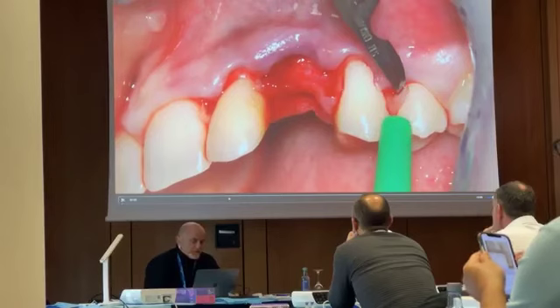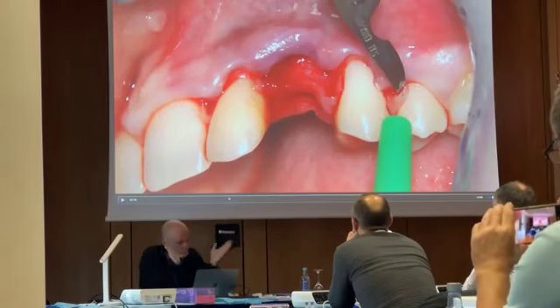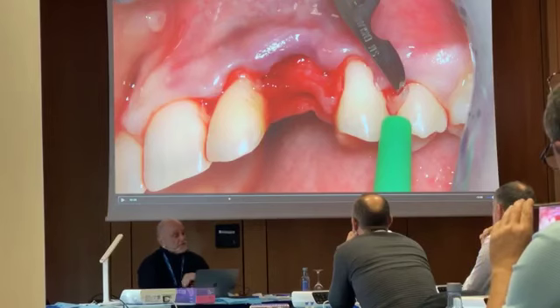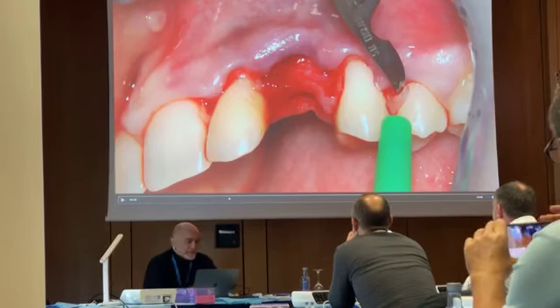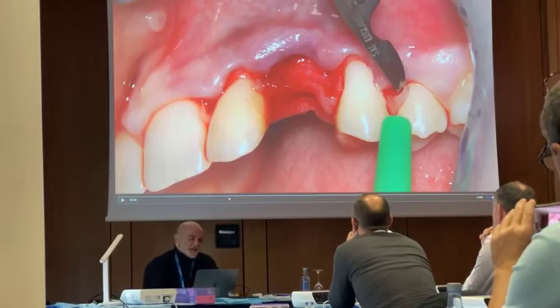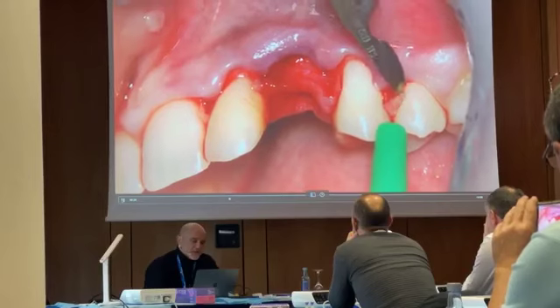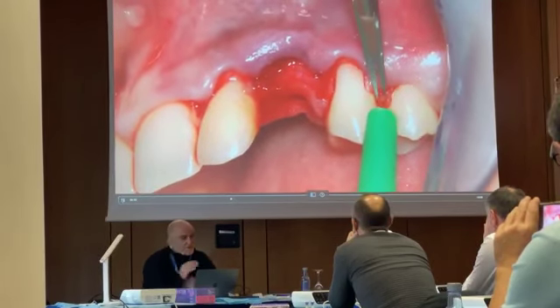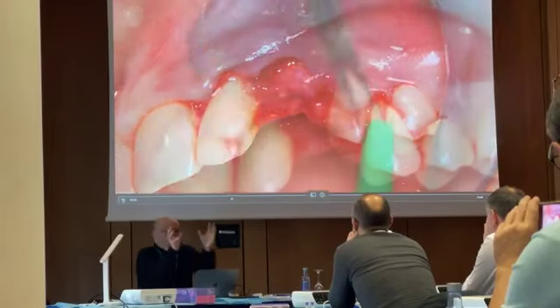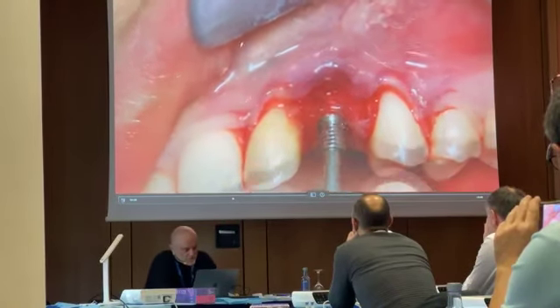The incisions that we did at the level of the adjacent teeth are paramarginal and convergent to the edentulous side. So what is remaining coronal to my split thickness papilla elevation is the area of the anatomic papilla that is deepithelialized with the blade first, and then with the use of the microsurgical scissors in order to create a connective tissue bed for the advancement of the papilla in a more coronal position.